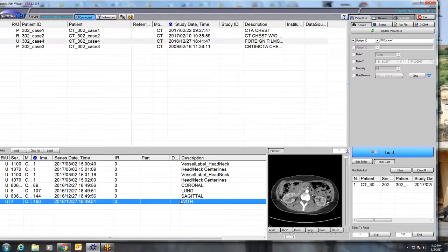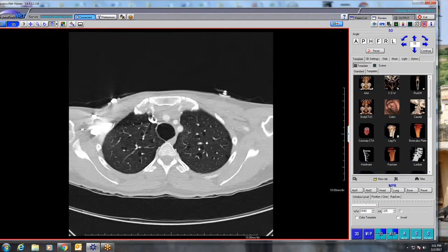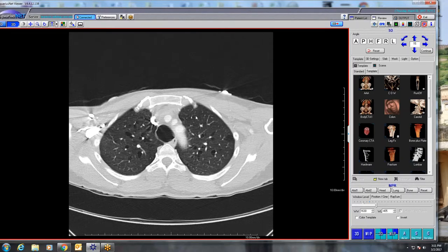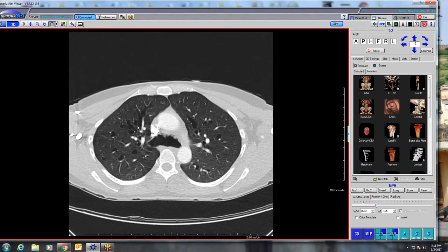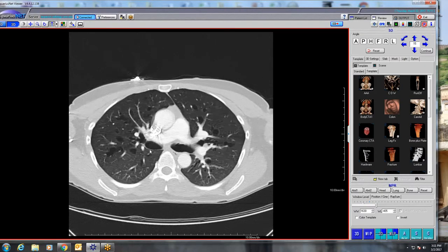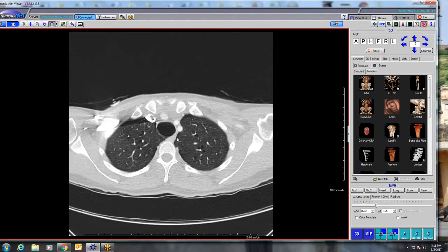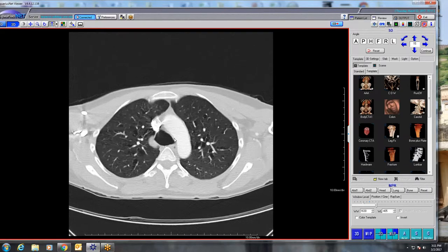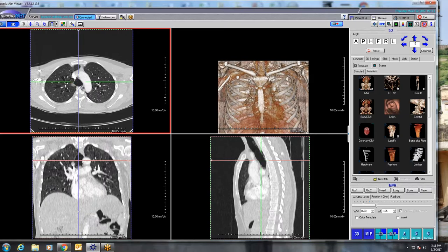This is a cool case — we talk a lot about Mounier-Kuhn and we see these very large patulous tracheas in smokers. This is actually a very massive trachea, and we get involvement of the central airways as well. Mounier-Kuhn has a striking male predominance — the literature says 19 to 1. You get central bronchiectasis up to a point. They say fourth-order bronchi, but you can get worse bronchiectasis farther out because of repeated infections. You're supposed to use different sizes of trachea and bronchi depending on whether it's a man or a woman.